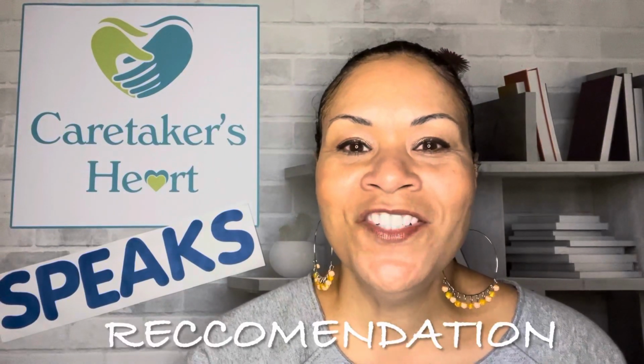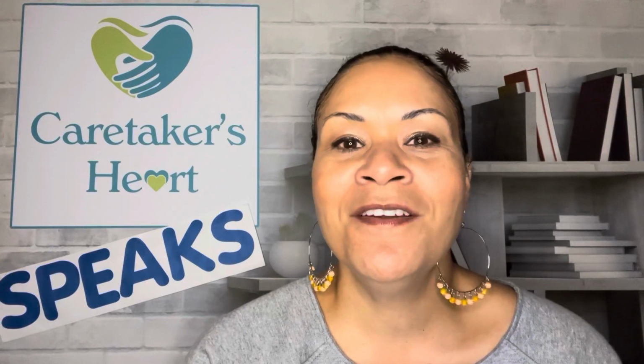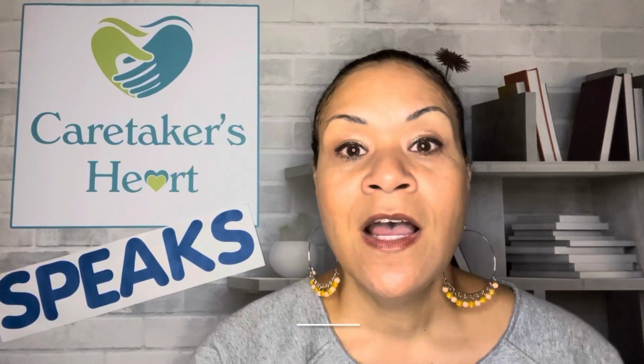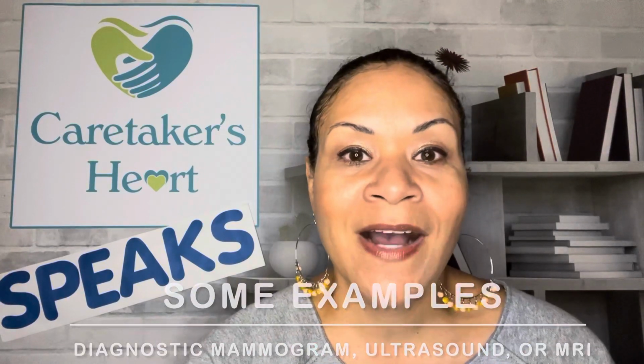In the recommendation section, which comes next, the radiologist will tell you if you're good to go and if you can get a mammogram on an annual basis, or like I said, every 2 years, or if you need a short-term follow-up, which could be a 3 or 6 month follow-up with additional imaging, or it could mean that you may need additional imaging immediately, a diagnostic mammogram or ultrasound or an MRI.